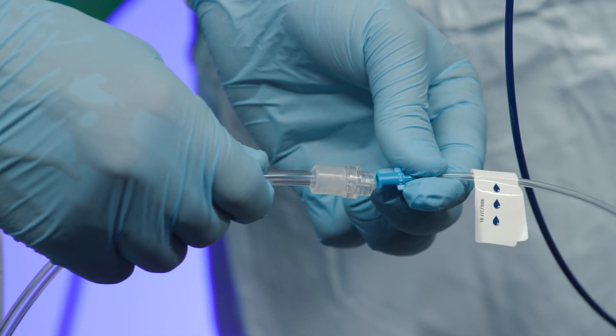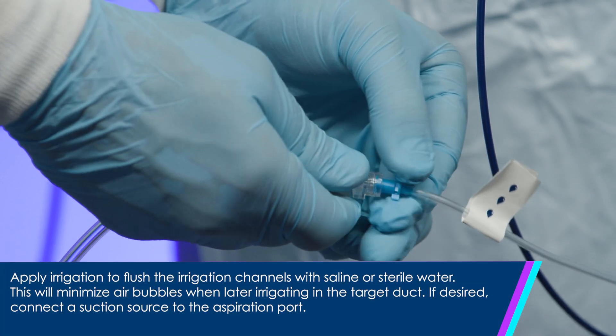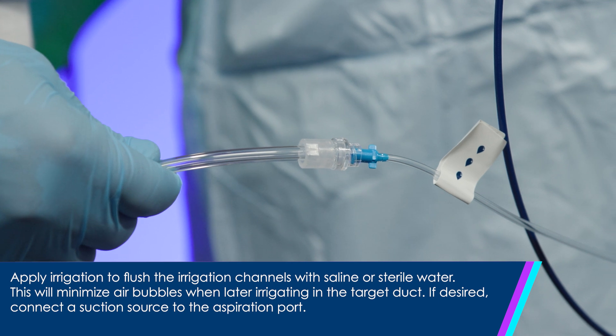Connect the irrigation tubing to both the irrigation pump and the irrigation port. Apply irrigation to flush the irrigation channels with saline or sterile water. This will minimize air bubbles when later irrigating in the target duct.